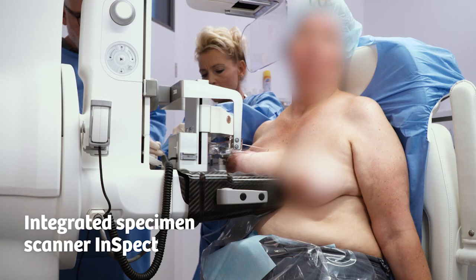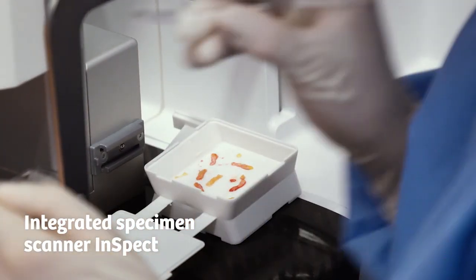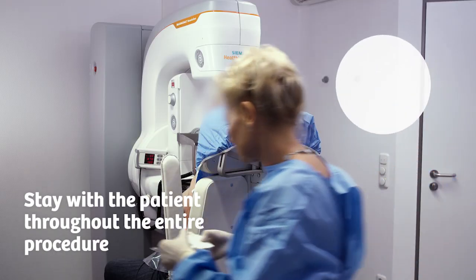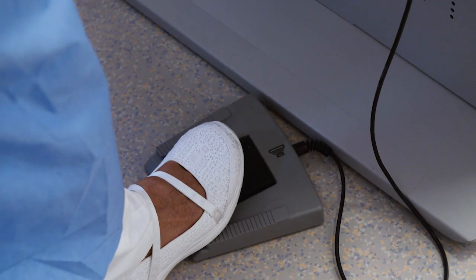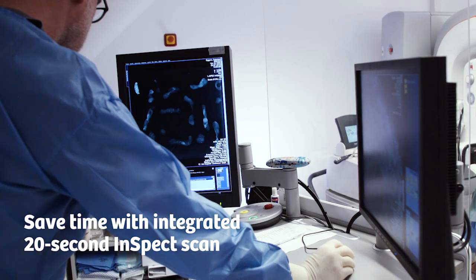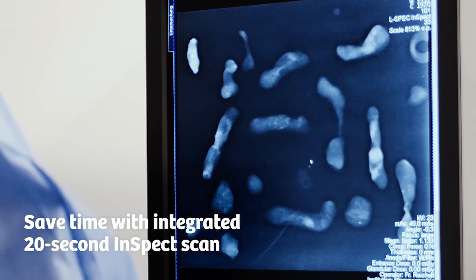The tissue scanner has many advantages. We can examine the tissue specimens directly during the examination while the patient is sitting still compressed in the same room. We don't need to leave the patient alone, and we don't need any further equipment to examine these specimens. This speeds up the whole examination, and we can see immediately, are all of the calcifications present? Can we finish the examination, or do we need to take further specimens?